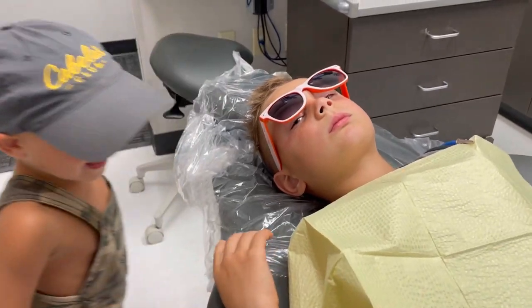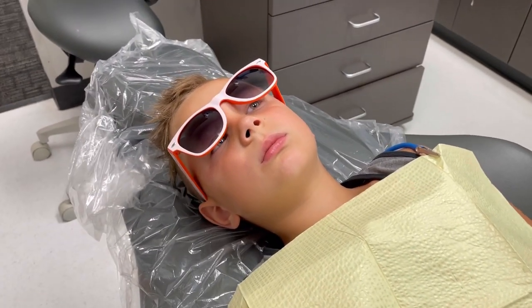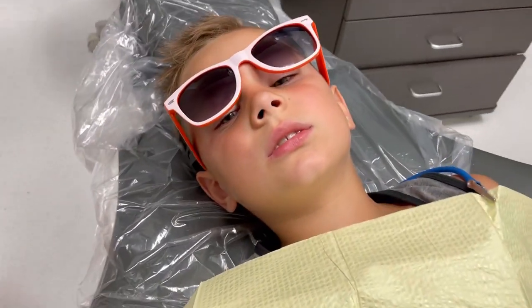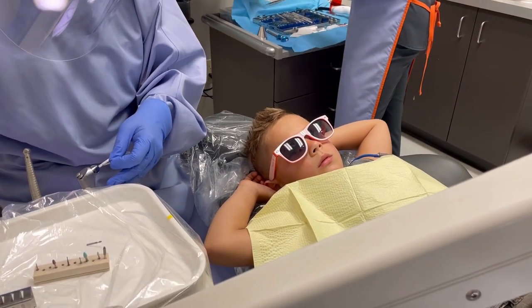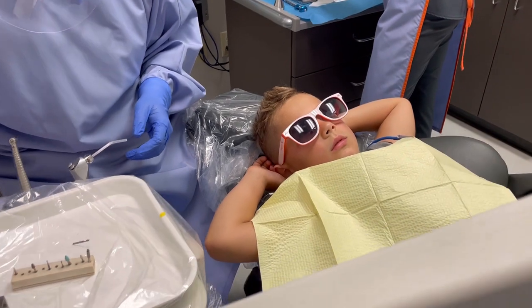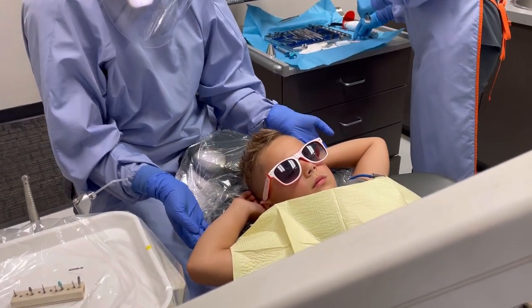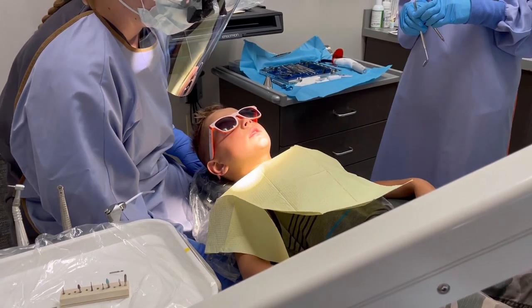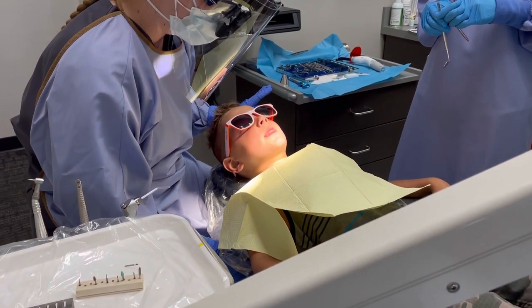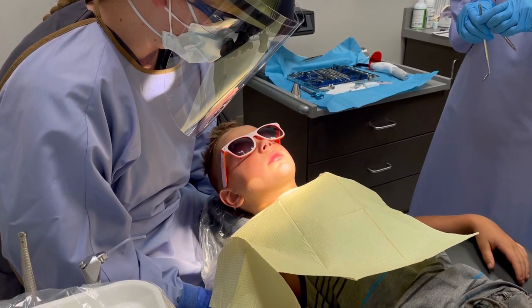Sammy, you're so brave. You're the best big brother — you're showing such a good example to your little brothers, Phillip. I love you. When I'm scooping stuff out, you're going to feel little bumps while we clean out the cavity or the sugar bugs. Go ahead and slide up in the chair so your head comes all the way to the top. If you don't like anything or you want me to stop, you just give me a little hand wave — raise this hand just like this. That's my signal and we'll stop and check in.